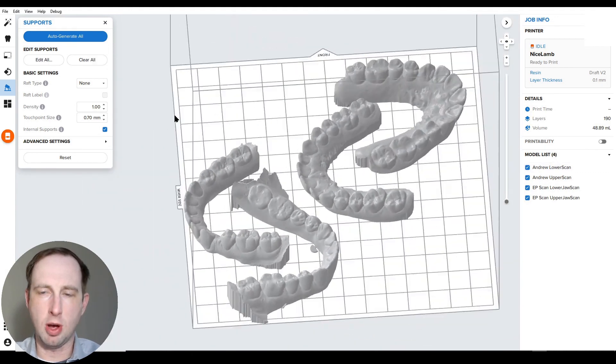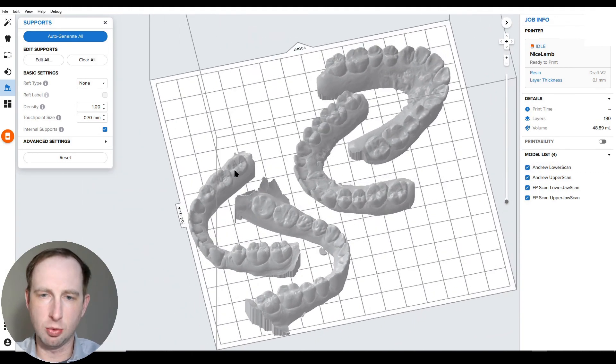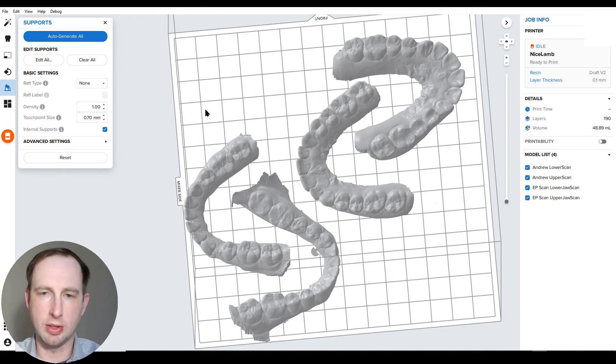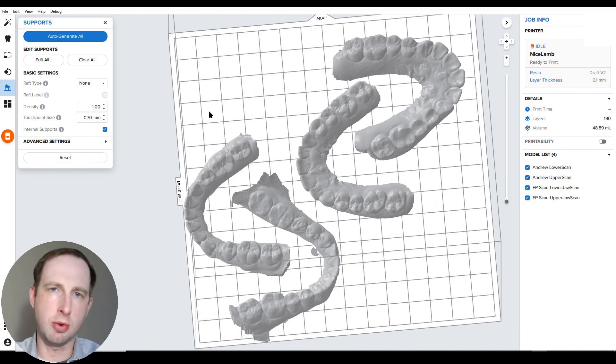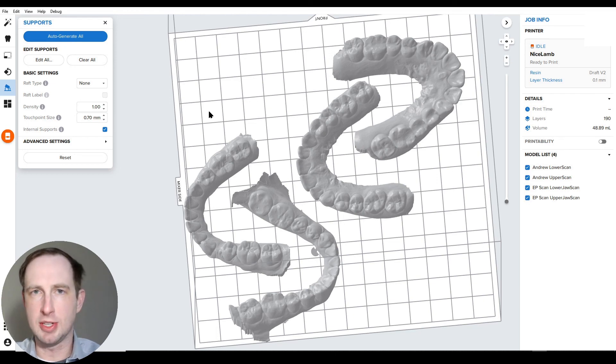Okay, so we've got our four models here and we're just ready to send the job to the printer. That does it for this video. I've got some other ones that I want to make. I hope you check them out and I hope this was useful. Again, my name is Sam, and this is Formlabs Dental.